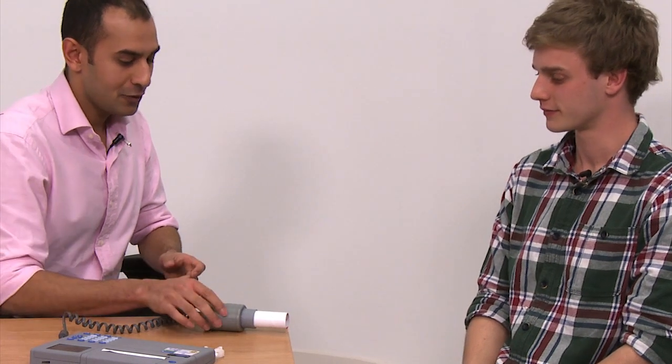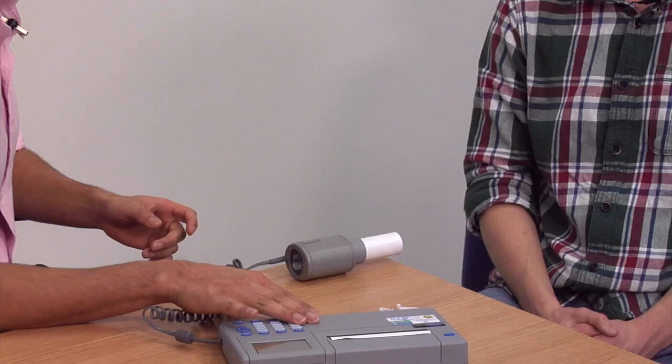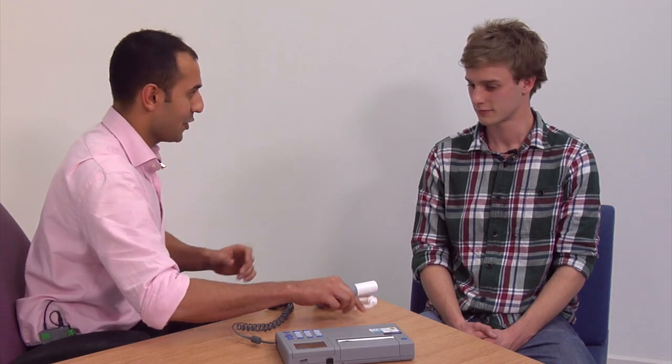Hi there. Today we're going to do a breathing test called spirometry. It involves blowing out into this mouthpiece, and this machine called a spirometer measures how well you blow out. This sometimes makes patients feel a little bit dizzy or lightheaded, so we're going to have you sitting down throughout. We'll also ask you to wear this nose clip just to make sure you're only breathing through your mouth, which can be slightly uncomfortable. Is that all right? Have you taken any inhalers today?